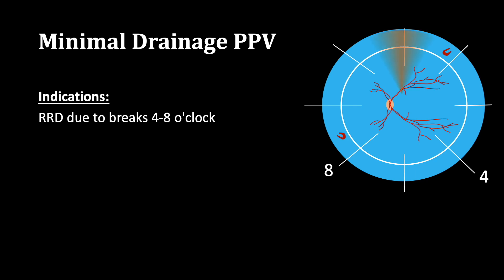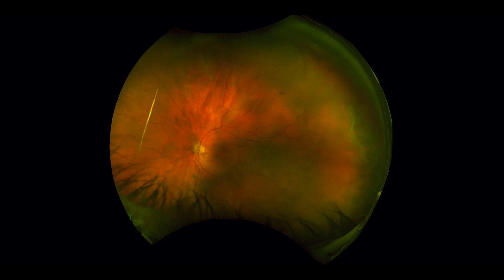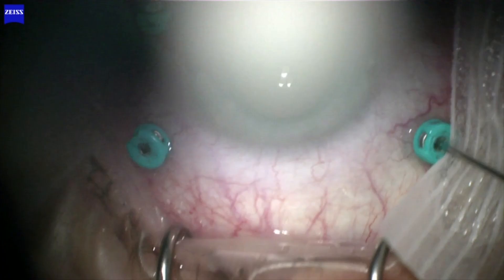We present a modified technique for vitrectomy used for retinal detachment caused by retinal breaks in the upper two-thirds of the retina. The technique relies on minimal subretinal fluid drainage. This is a case of a 65-year-old gentleman with temporal macular-off retinal detachment. PVD was present and there was a temporal horseshoe retinal break with associated retinal thinning. The patient was phakic. 25-gauge vitrectomy was undertaken.